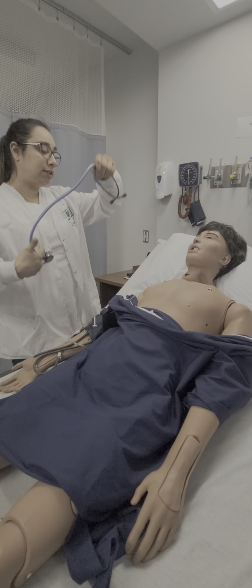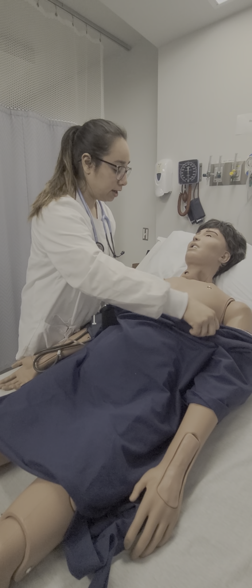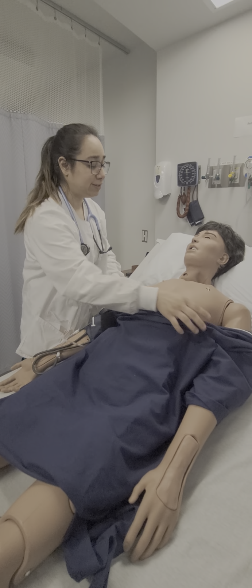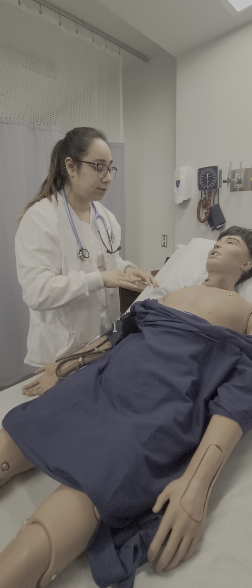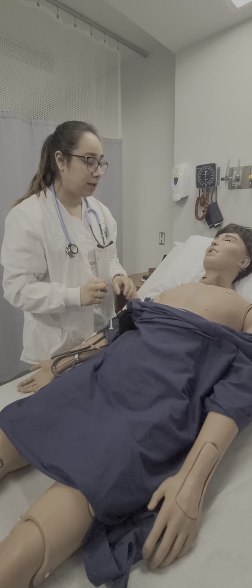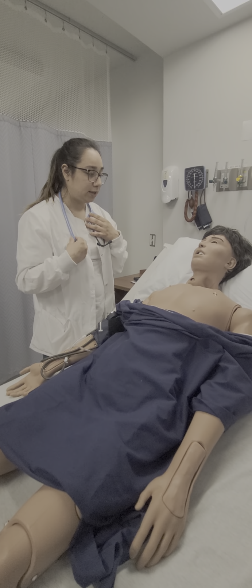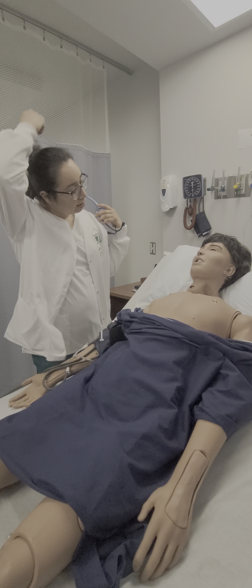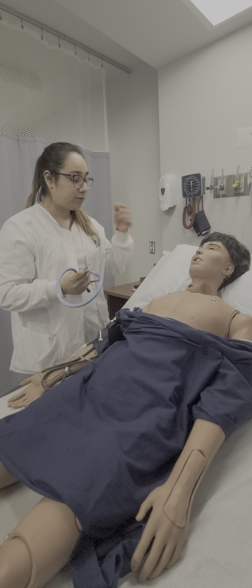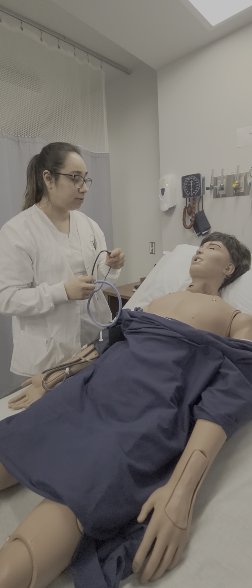Good. Your lung sounds are clear. I hear no crackles or rhonchi. Lung sounds are clear bilaterally. No sounds of crackles or rhonchi. They sound normal. I'm now going to listen to your heart sounds, okay?